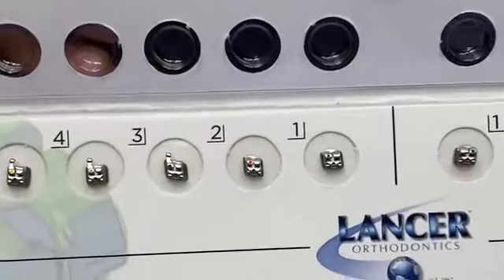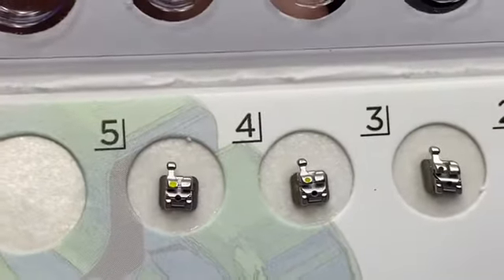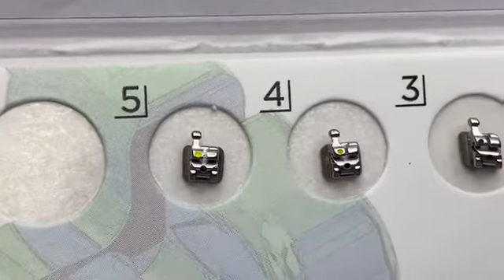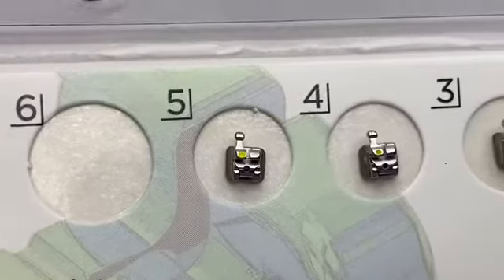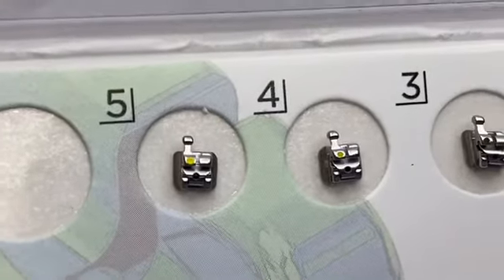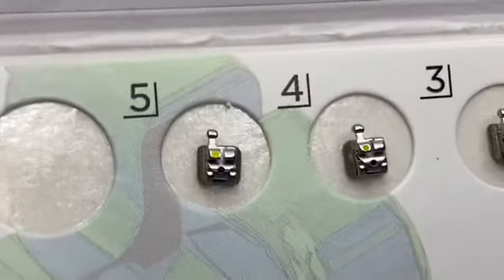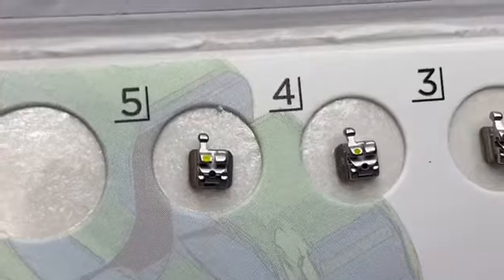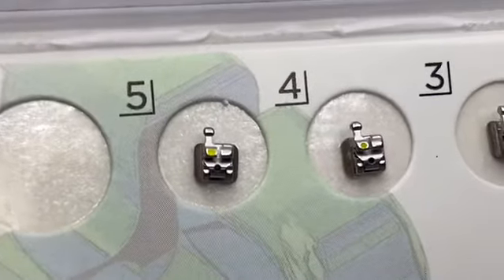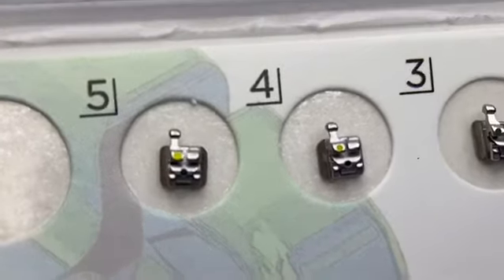And I want you to see each of the self-ligating brackets. This is tube number 4, or upper right. They call upper right 5 in orthodontics. You see how there's a hole there — you just need to put the explorer and push it. Once you snap the wire, you just need to push it up. It will snap the wire inside.